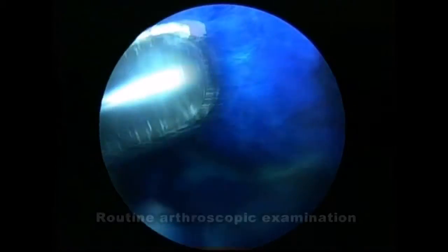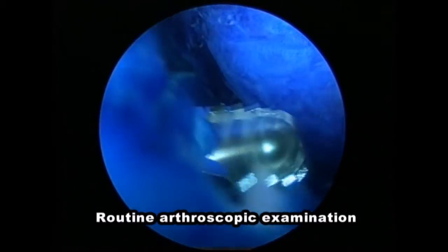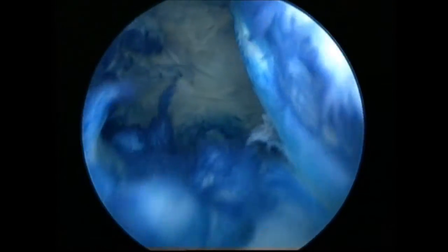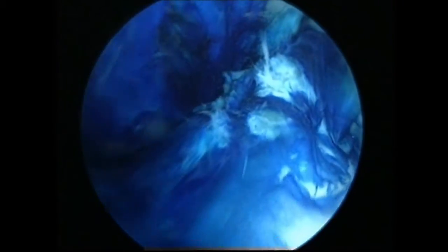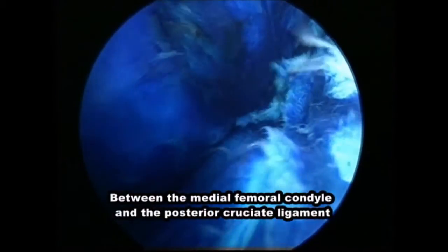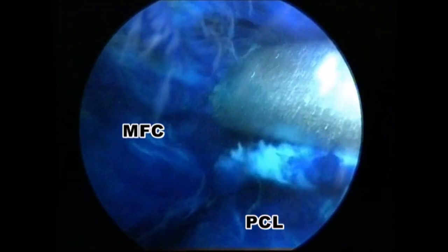Routine arthroscopic examination of the knee joint was performed through the standard anterolateral portal with a 30-degree arthroscope. The scope was then redirected between the PCL and the medial femoral condyle to create the standard posteromedial portal.